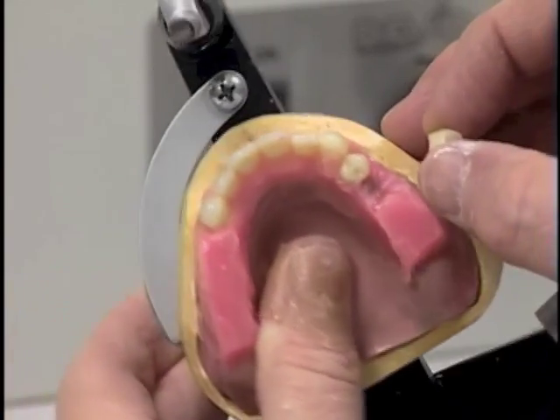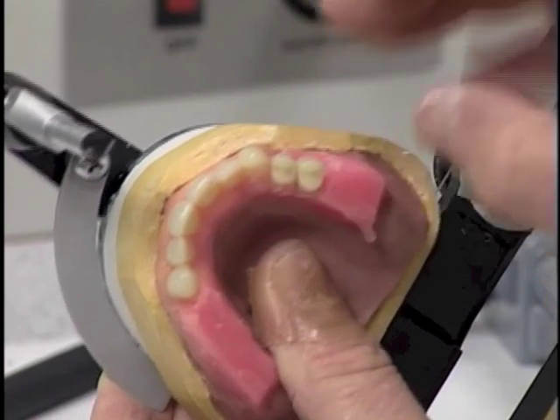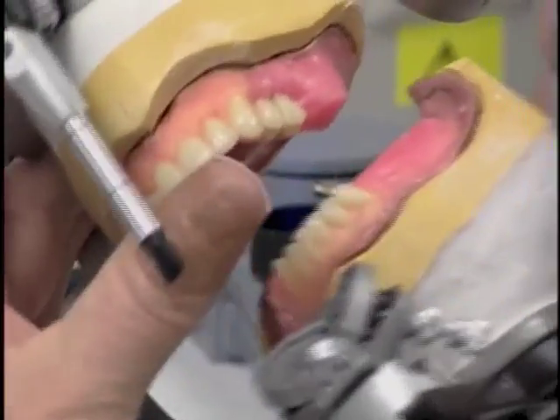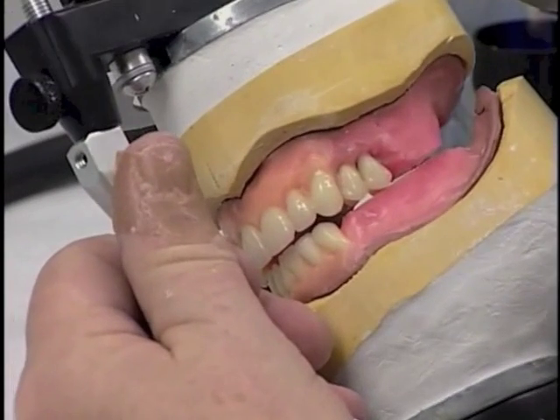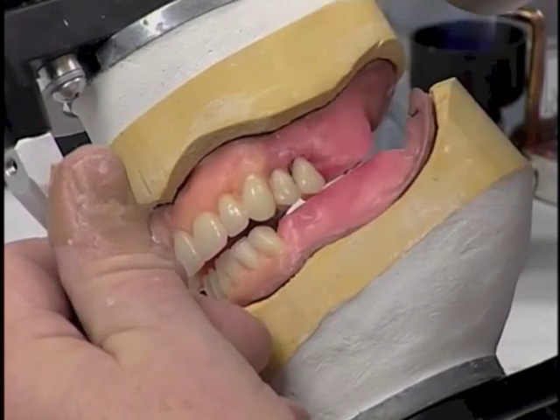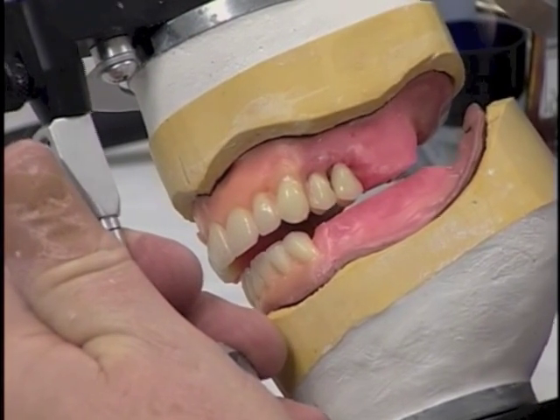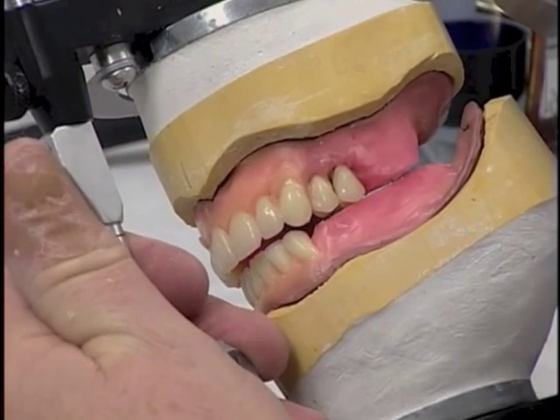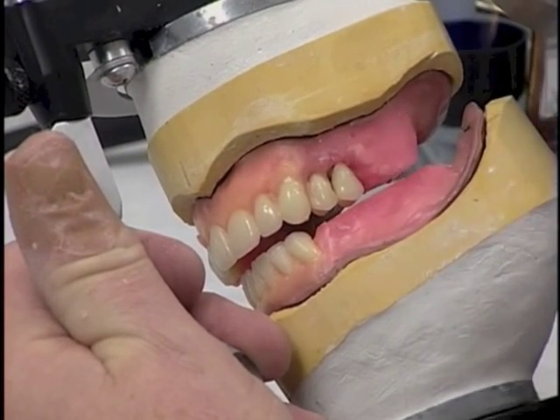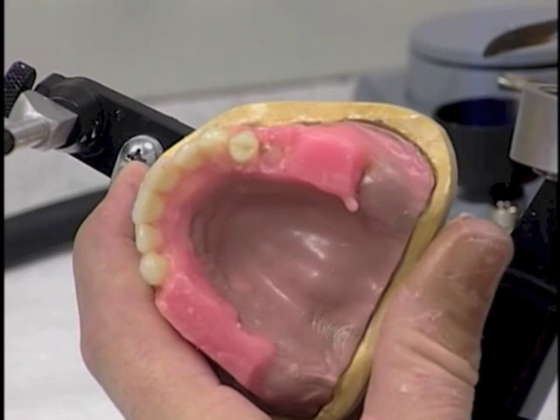So we get the second premolar, place it into the arrangement. As we place that tooth, we want to see to it that the long axis turns out virtually vertical. And what we see when I look at this point, that tooth needs to be raised up just a little bit. It's hanging just a little bit too low. If we look at the plane here, we're about 1 millimeter too low, so that tooth needs to be raised about 1 millimeter. So we'll remove the tooth once again.